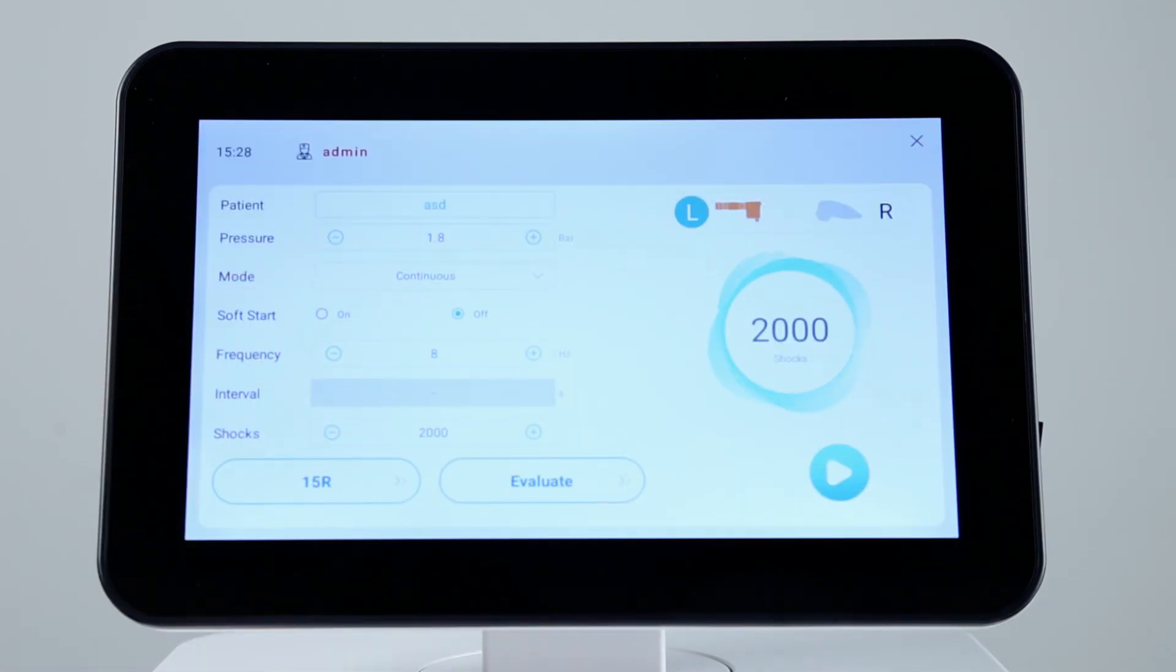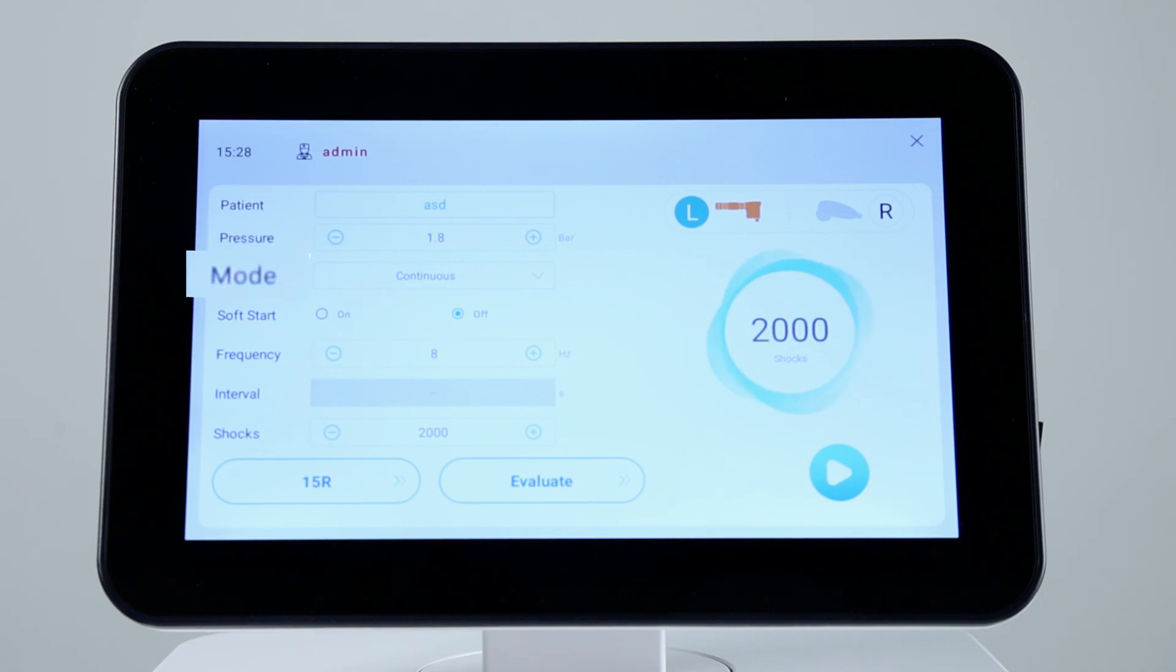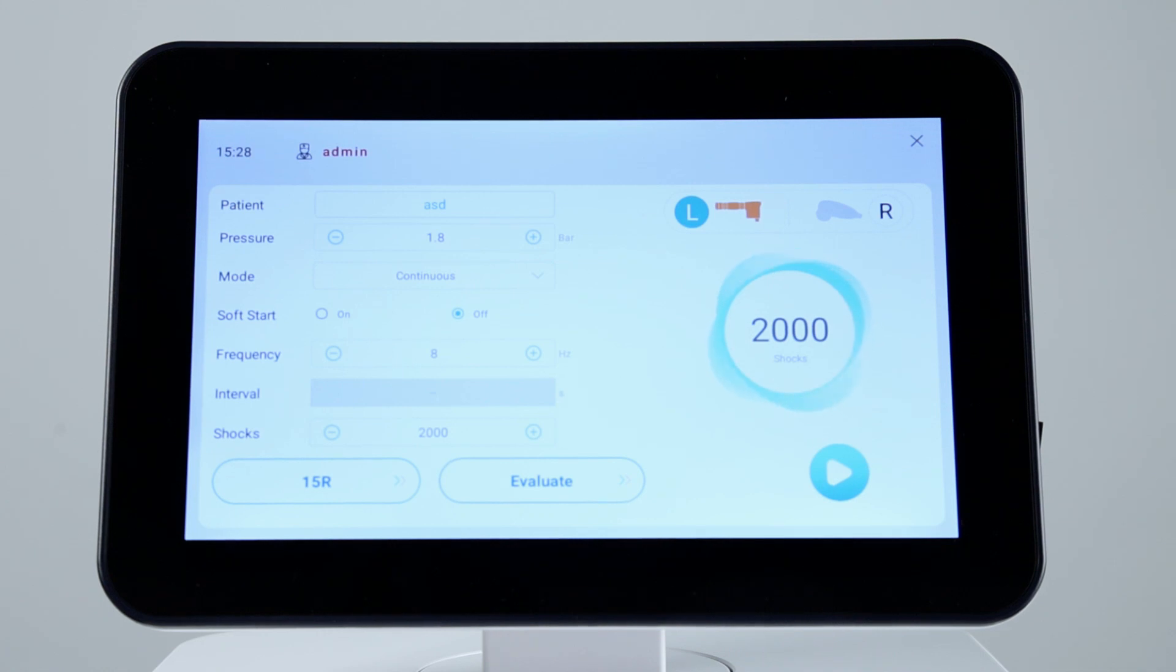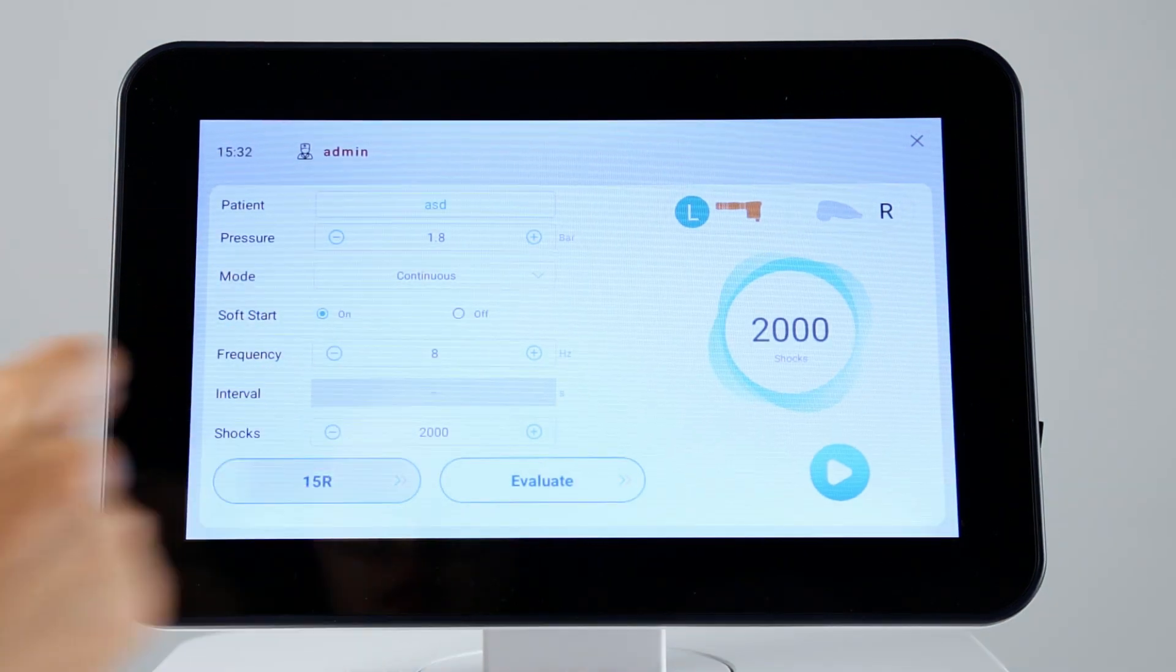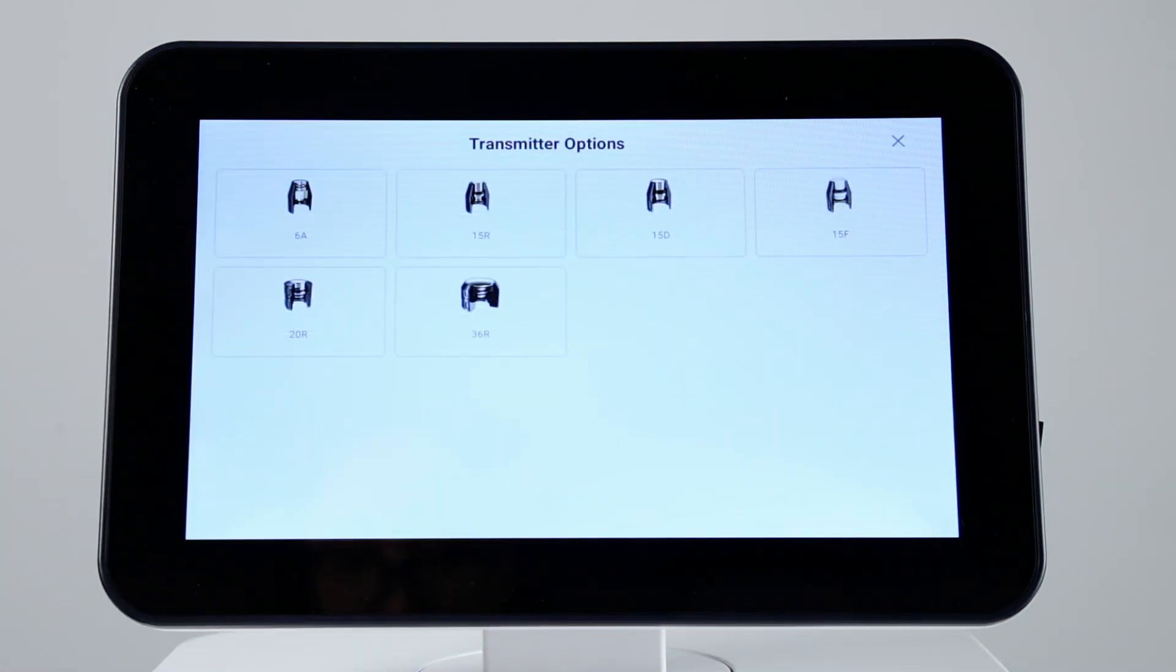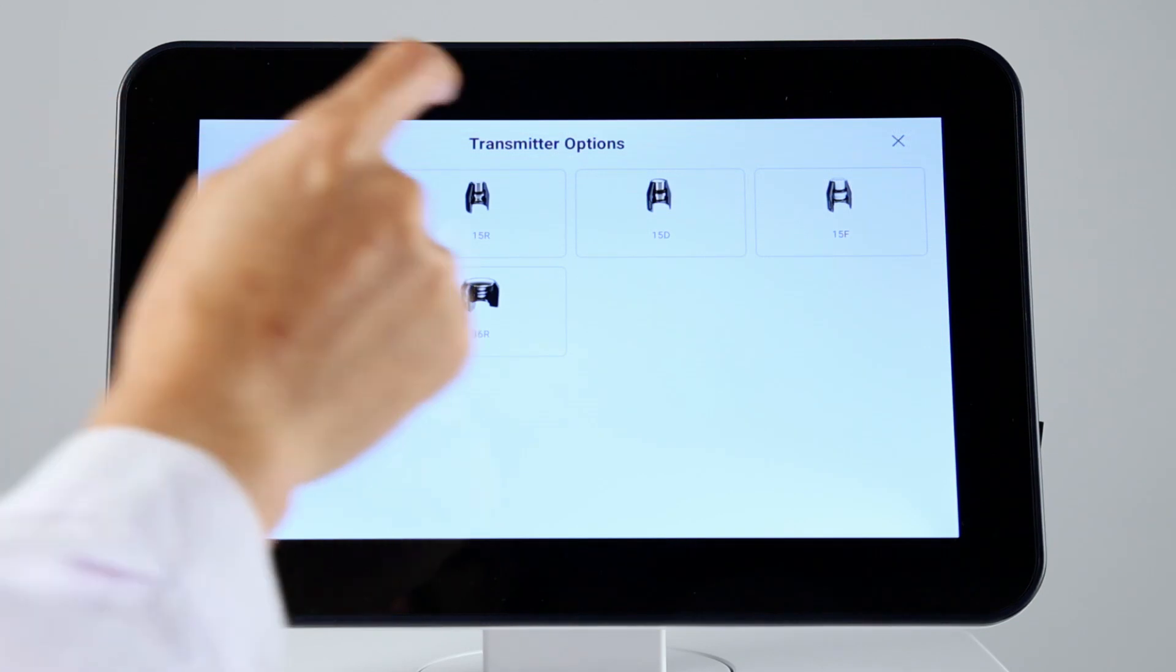The treatment parameters like pressure, mode, frequency, and number of shocks is preset. You don't need to adjust them. Then select the transmitter used for the treatment.